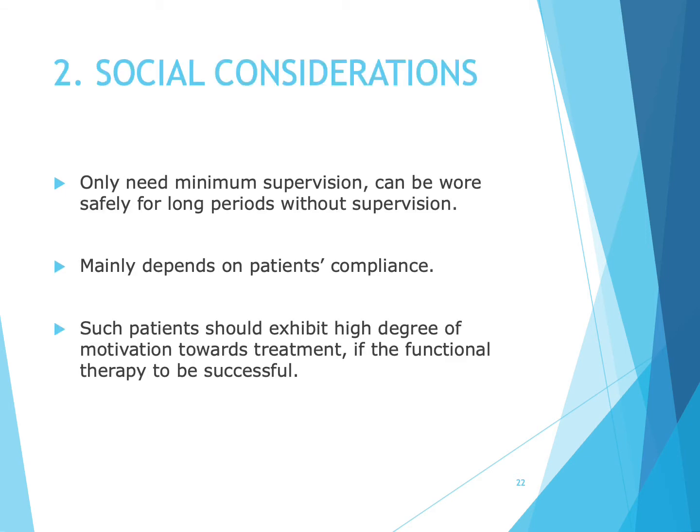For social consideration, as stated by Anderson, functional appliances achieve their result with minimum supervision and, unlike fixed appliances, can be worn safely for a long period without supervision. Unfortunately, all cases cannot be treated with functional appliances alone. Patients who live far away from the clinic or those attending boarding school may benefit from these appliances, provided they fulfill all the criteria for case selection. However, such patients should exhibit a high degree of motivation if the functional therapy is to be successful.